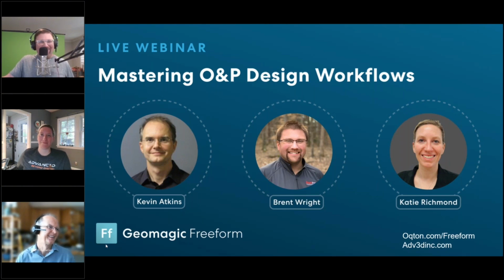Try the haptic device. And he tried it, and he texted me. He's like, okay, this just opened up a whole new world. So the haptic devices, the one that I like that has the buttons on it, there are two. One is the expensive one. That's the way I know it, at least.